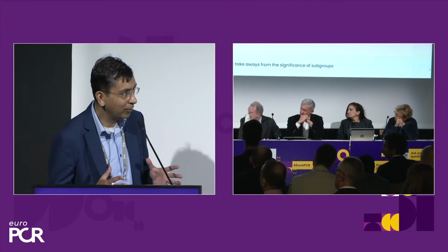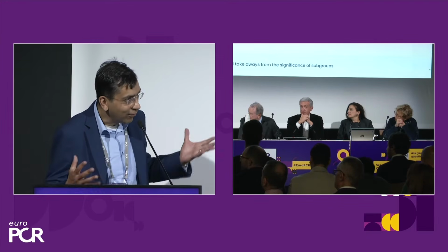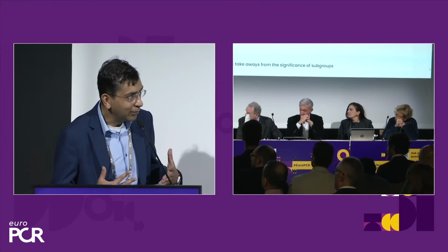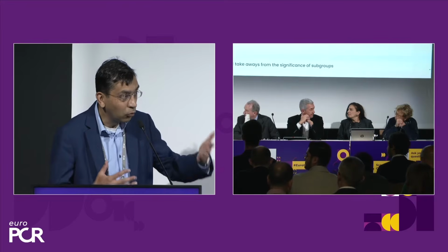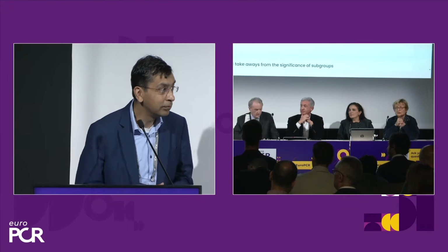With paclitaxel. Yeah. Well, I think that speaks to the function of the media, which is contraction. And so you want vasodilatation. When you exercise, your artery vasodilates. The muscle cells relax. They accommodate to the demand of the myocardium. So I think vasodilation and contraction are all important in terms of normal physiologic response. Do we know the responses are normal after paclitaxel-coated balloons? We don't really have that information. No. Okay. Thank you very much.